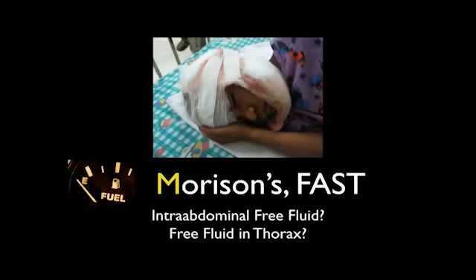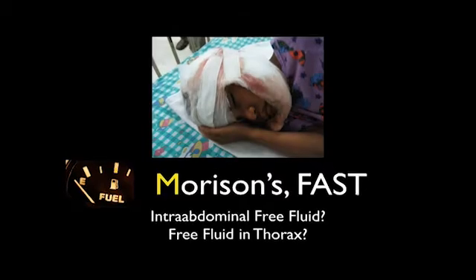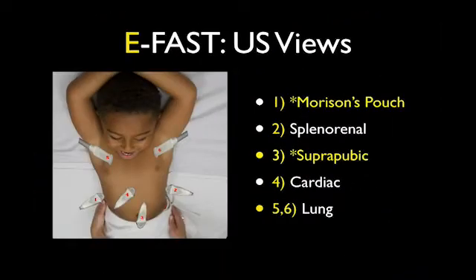So moving on to Morrison's FAST, this is just a super quick review. Is there fluid? Are you losing fluid? And is there free fluid in the thorax? So this is just a quick reminder of all the views of the FAST exam. You don't have to do all of these views. A lot of people will suggest that you just use the high yield view, and that would be Morrison's in adult patients.